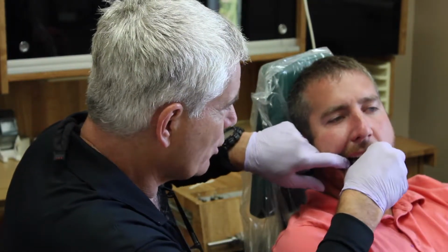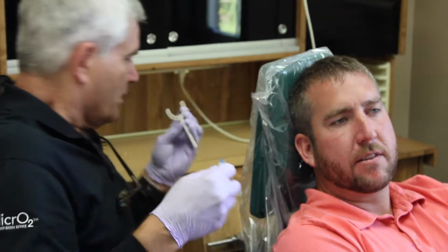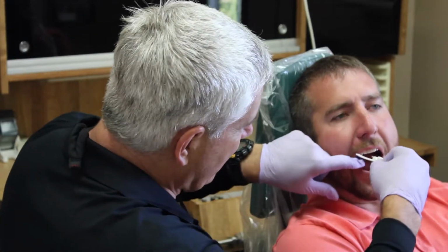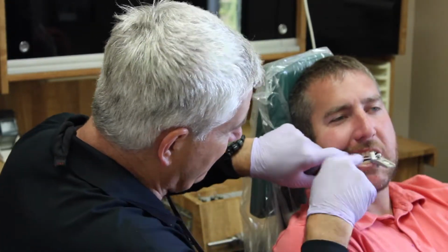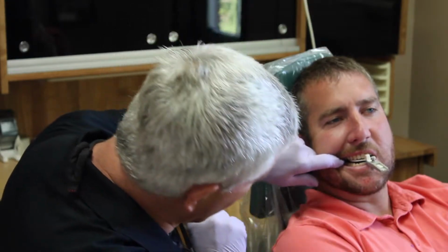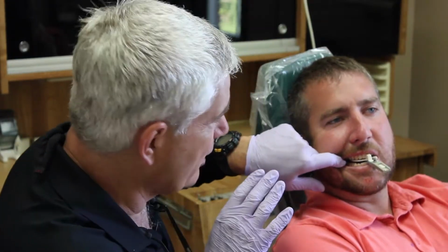So I'm going to have Jeff just open. I'm going to remove this gray bite fork. I'll put in the milky white one and check that, because that's got a little bit thicker pad there. Oh yeah, look how much more room we've got back there. That's excellent. Now I know I've got 3 millimeters of clearance. I might even have 4 there, so that's plenty.